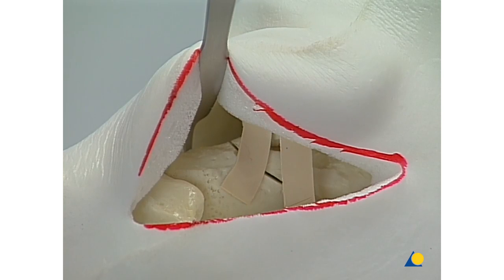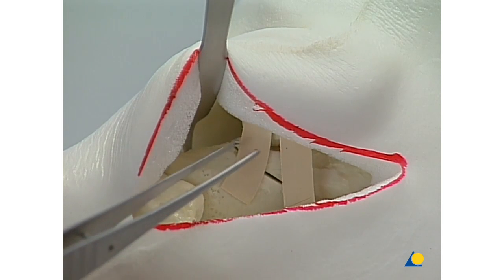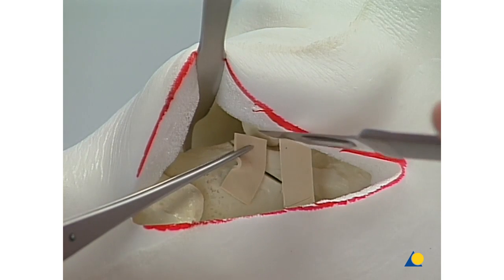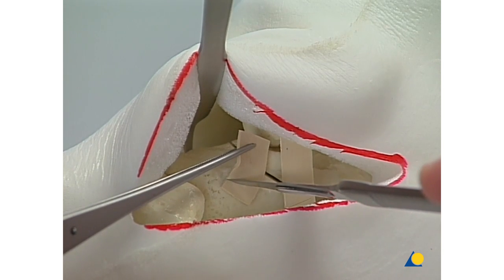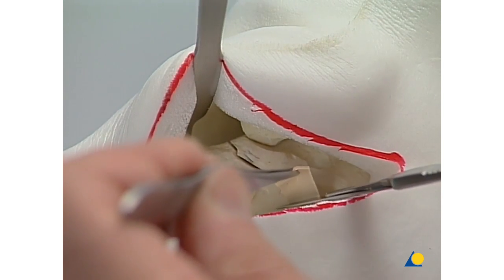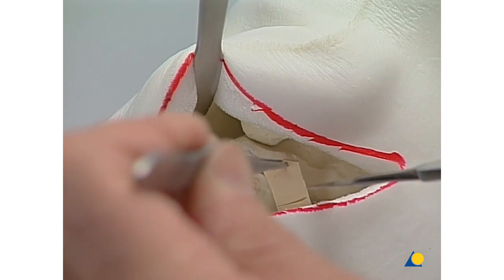In our model the fragments must be held together by rubber bands that do not correspond to anatomical ligaments. Before performing the exercise they should be removed using the scalpel and forceps.